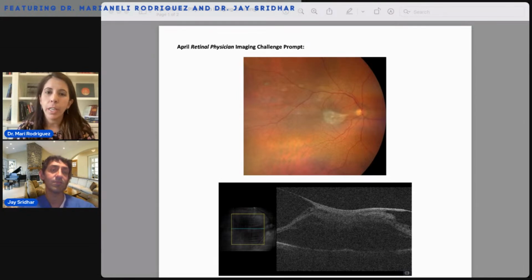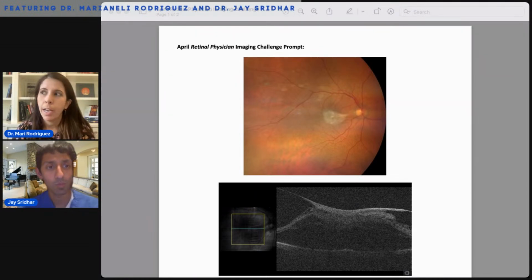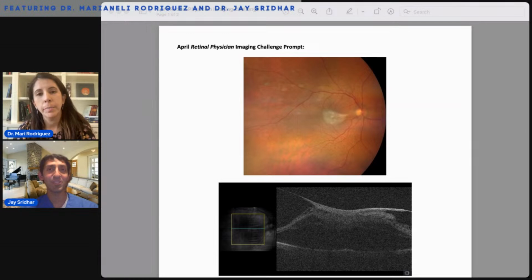I usually do Kenalog or Triessence, whatever is available, to stain the vitreous as I induce a PVD. And I use green ICG when I'm going to be peeling. And then do you do pinch and peel, or do you use a Tano or create a flap with something else? Yeah, there's so many ways to do a flap. I like pinch and peel. I find it reproducible. I know some people use a loop or a Tano or an MVR blade initially, but I like pinching and peeling.